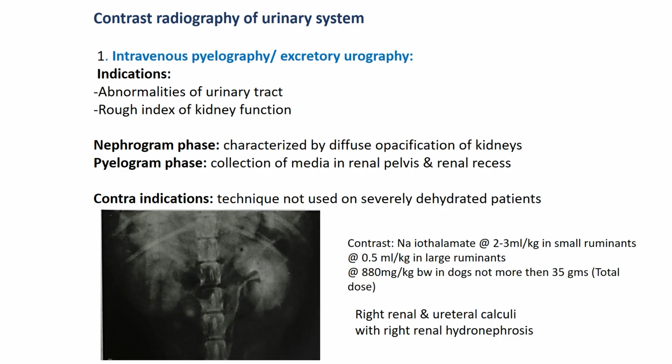So let's discuss the contrast radiography of the urinary system. In the previous lecture we have already discussed the contrast radiography of the gastrointestinal tract, peritoniography, cholecystography. Now today we are going to discuss the contrast radiography of the urinary system.